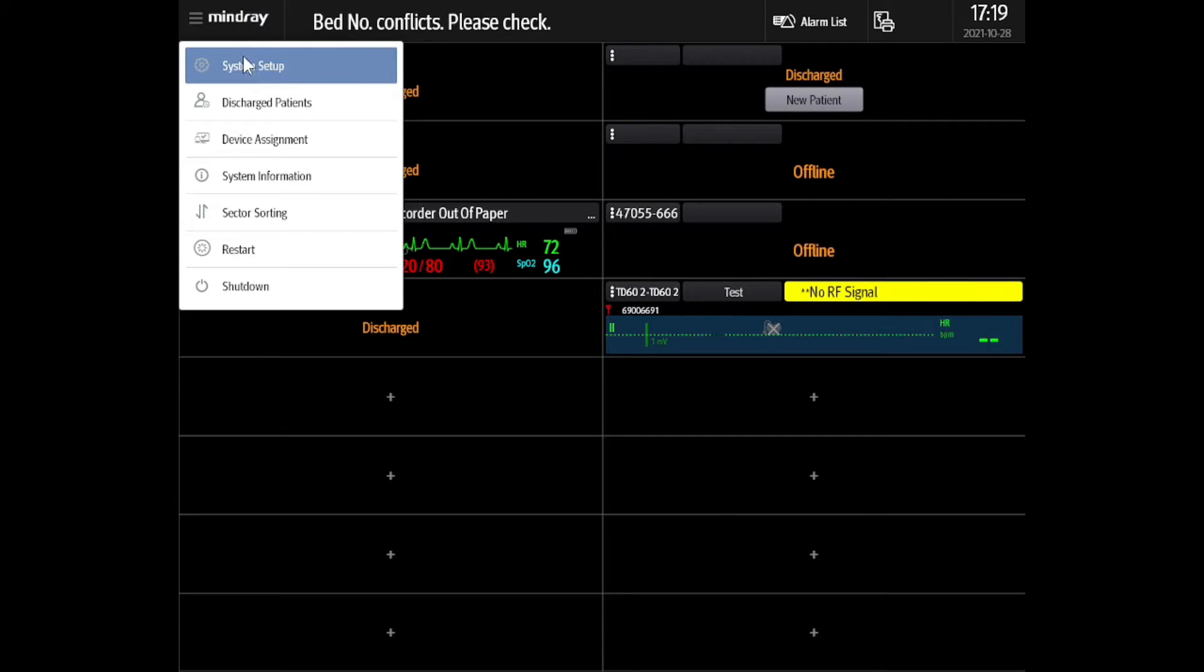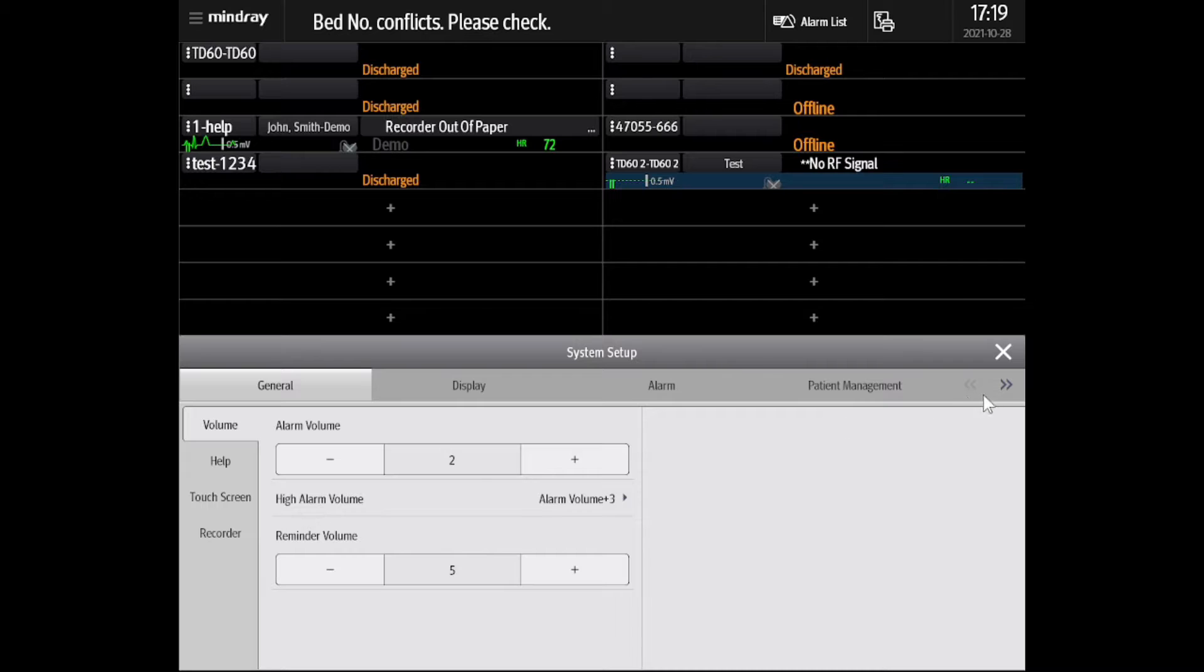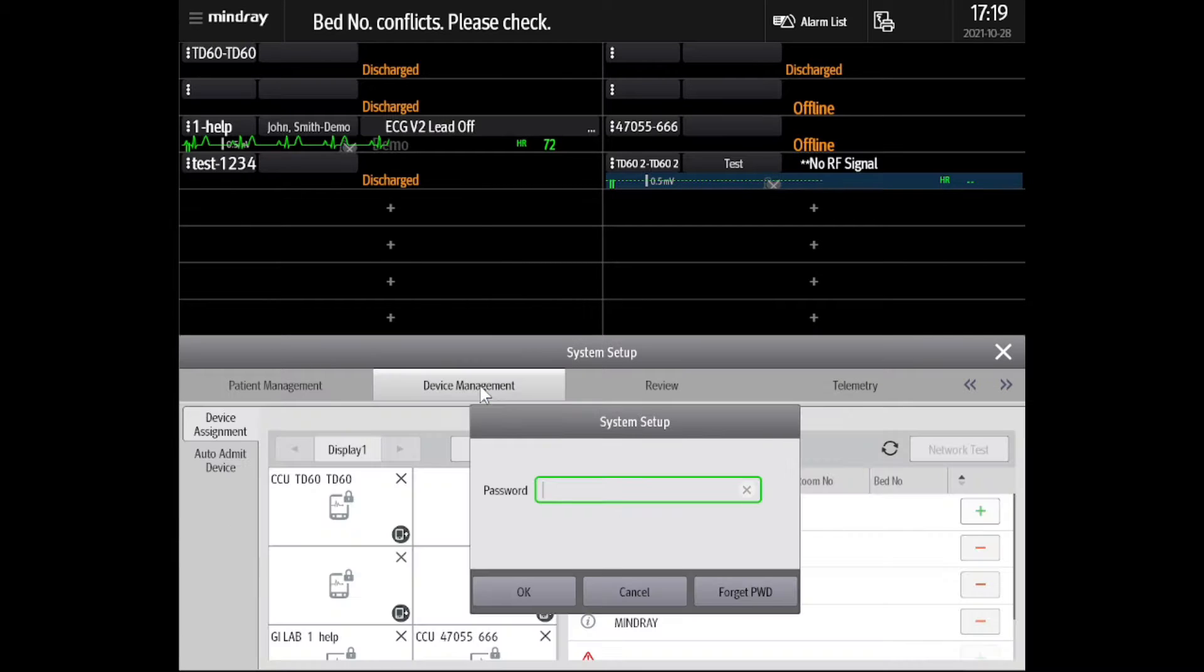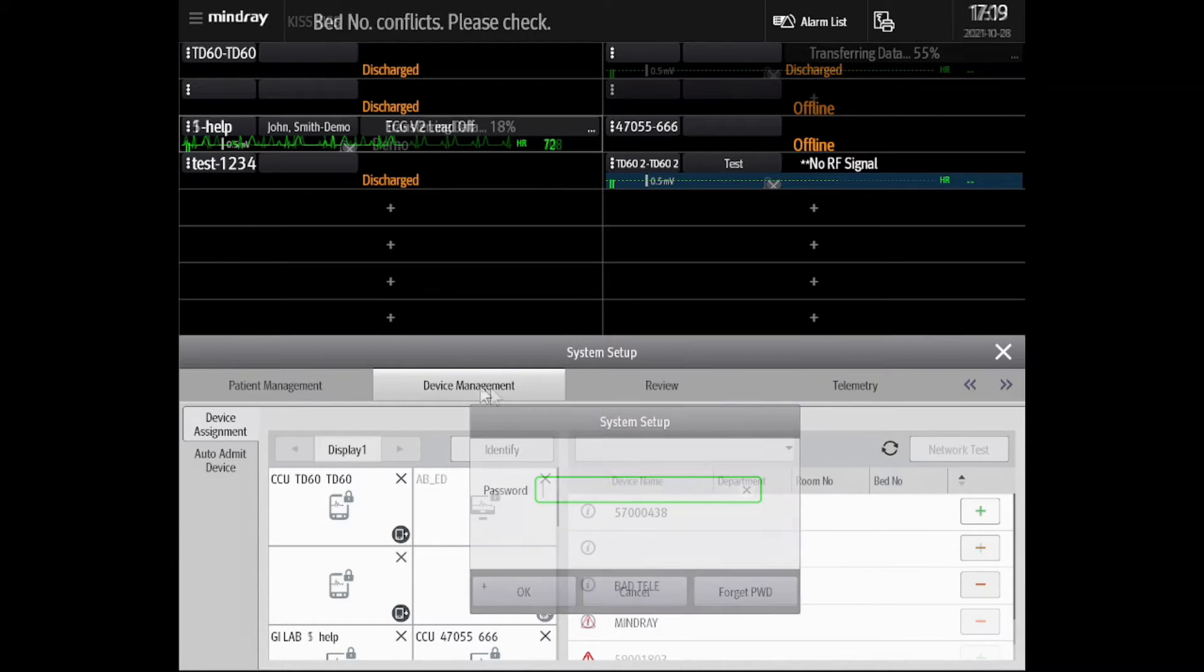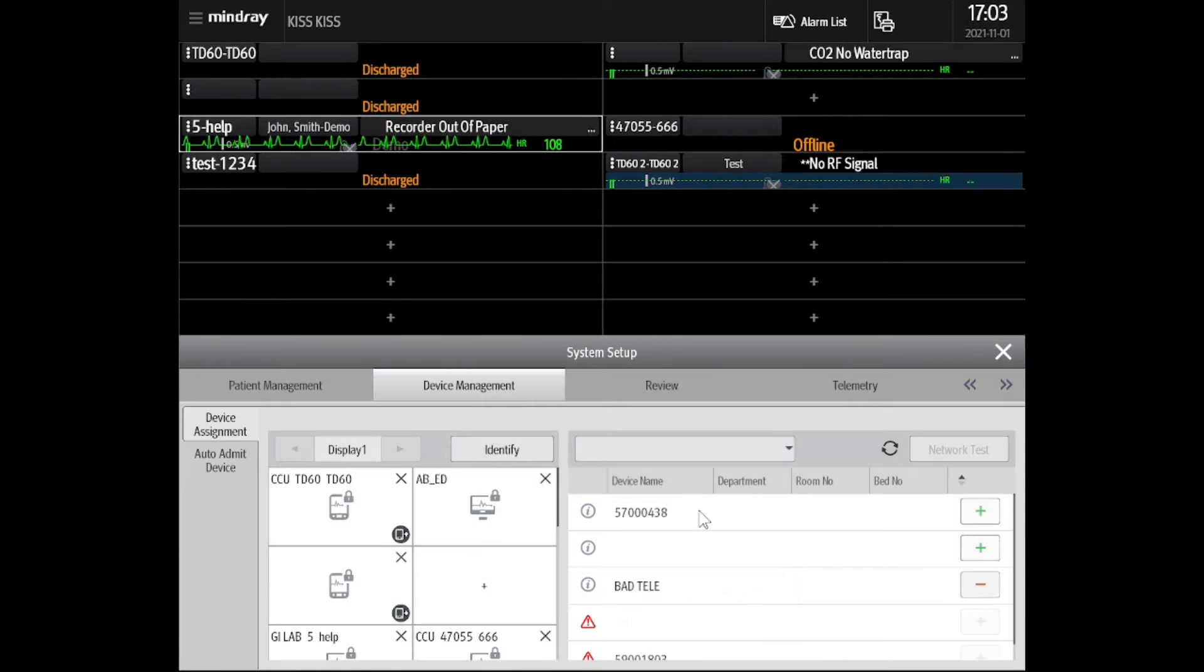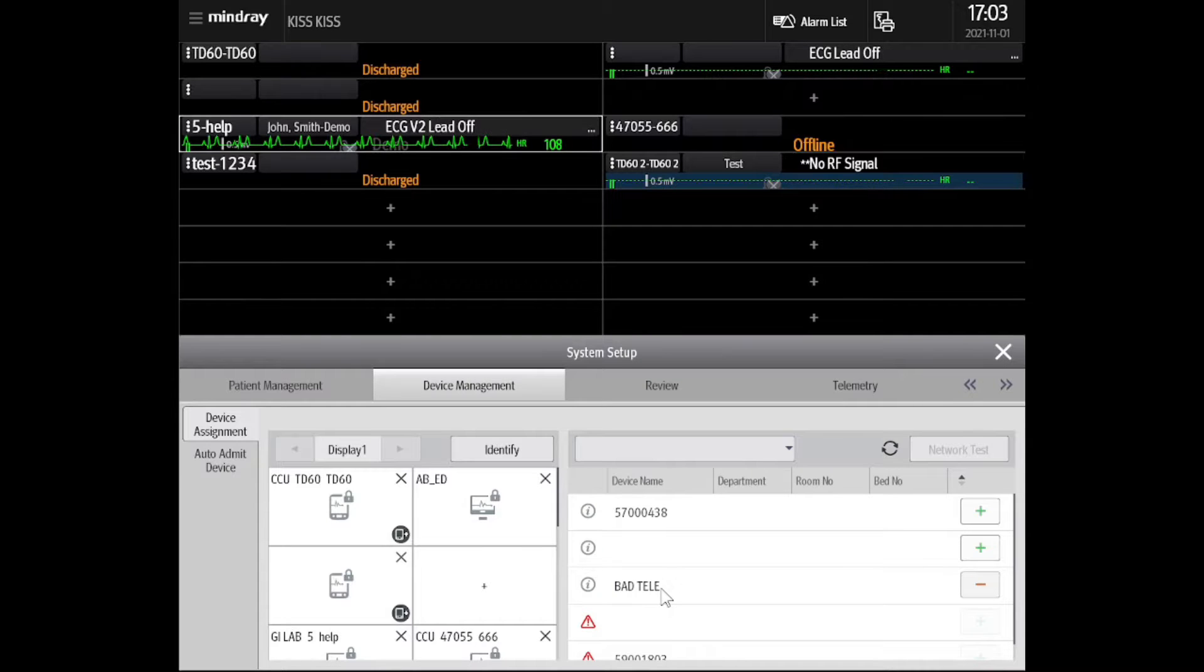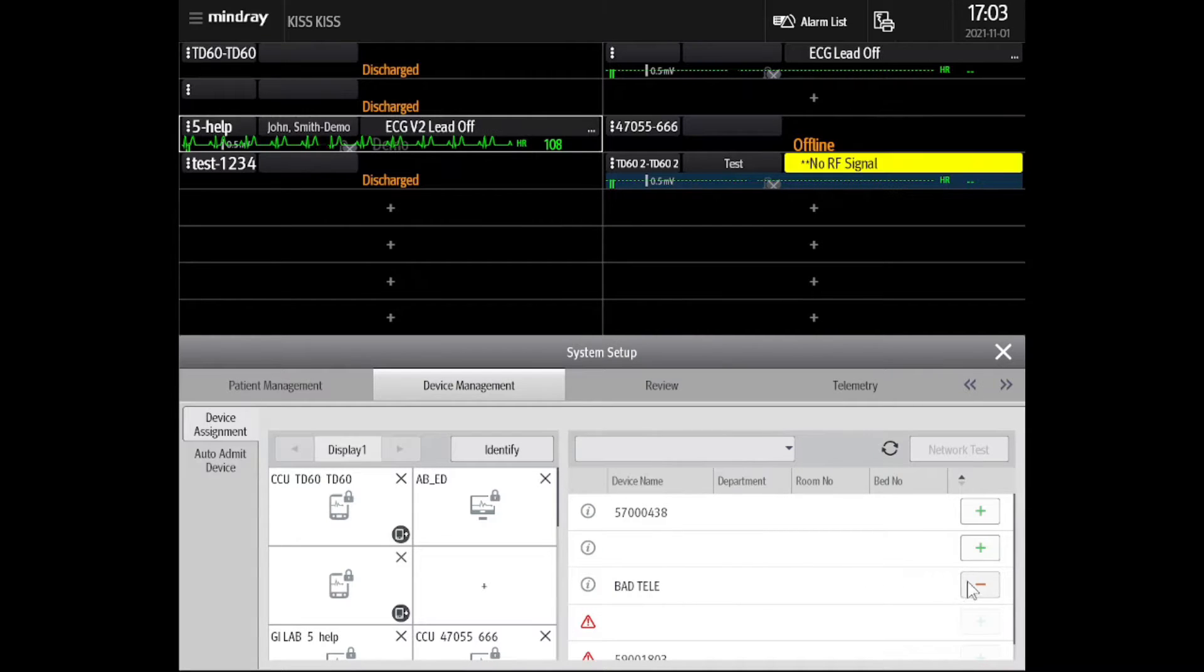Select System Setup and use the arrows to navigate and find the Device Management tab. Enter your current password or contact tech support for further assistance. Locate the problematic TM80 from the device list and select the minus button to remove it.